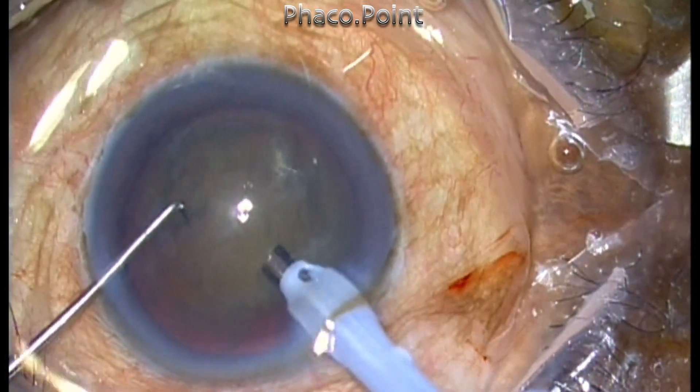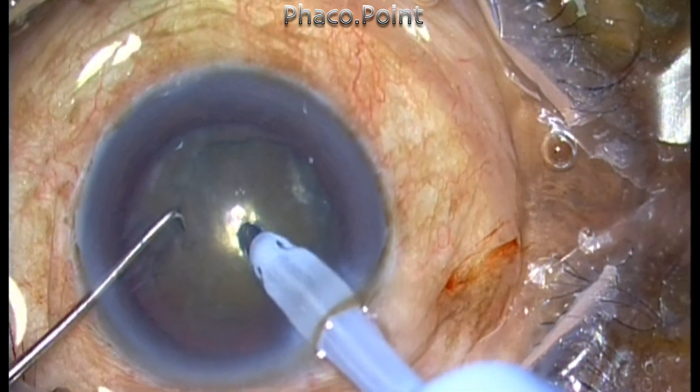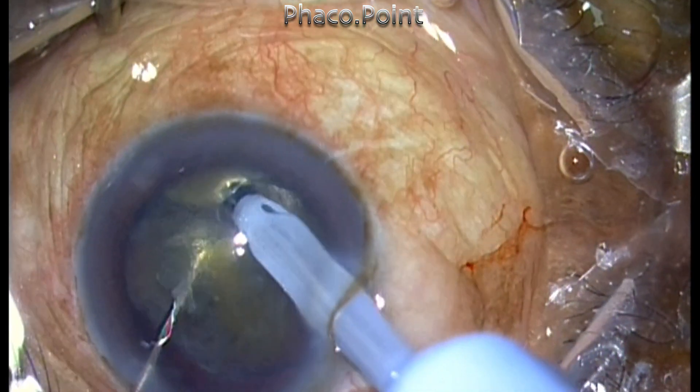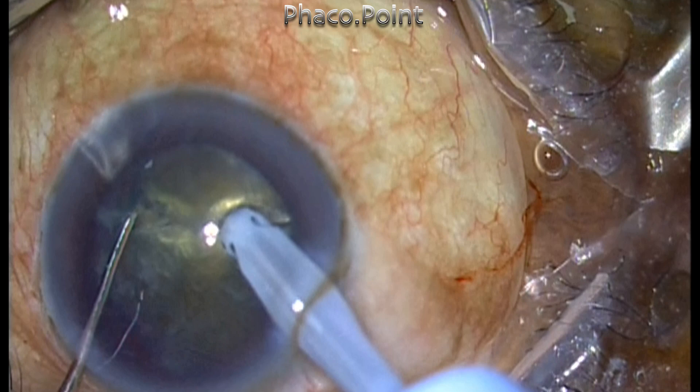I bury the phaco tip inside the nuclear substance and create the first chop. The phaco probe is buried deeper into the meat of the nucleus, and using the second instrument I am able to take it deep into the crack and create the chop.